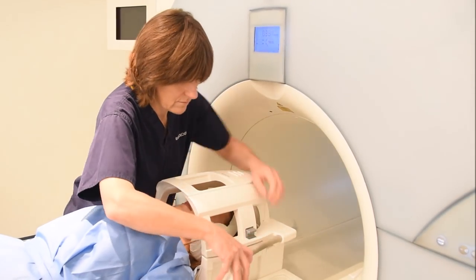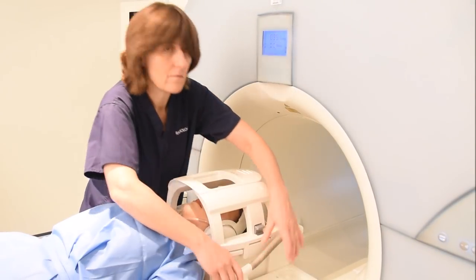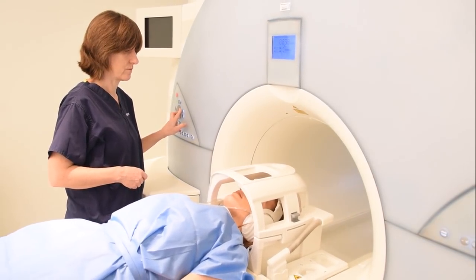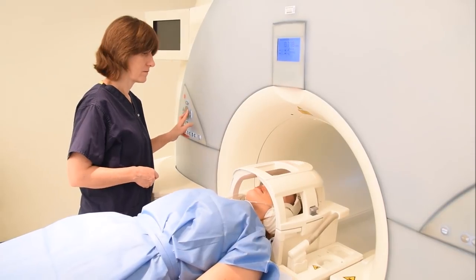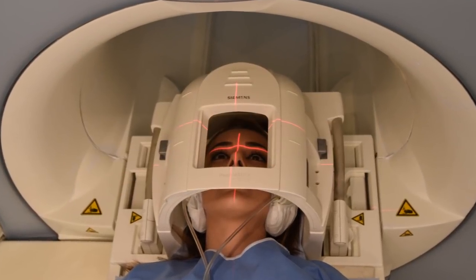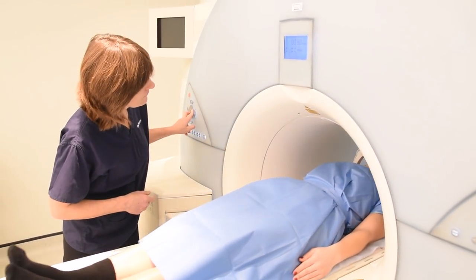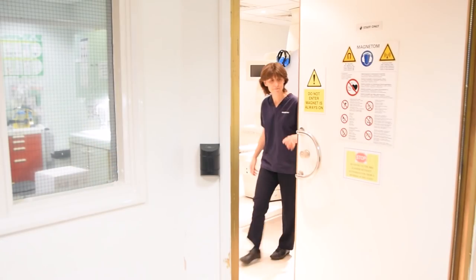Attach the head coil, move the patient carefully into the scanner and centre to the glabella. Then move the patient fully into the scanner, making sure they are calm and comfortable before leaving the room.